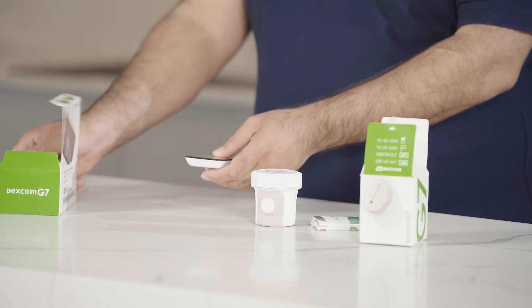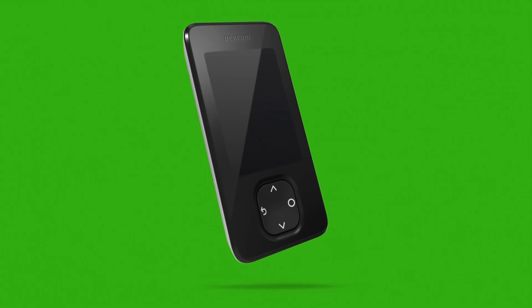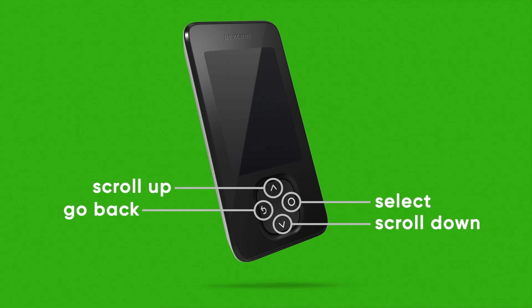USB cable, and power adapter. Your receiver has four buttons: Select, scroll down, go back, and scroll up.